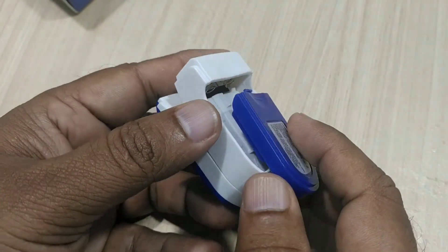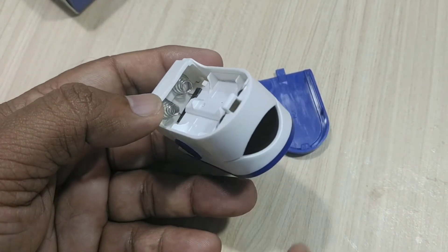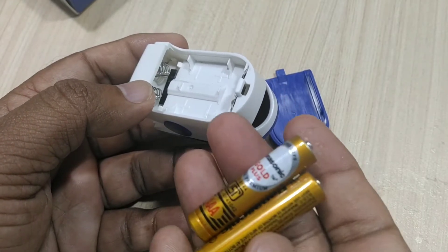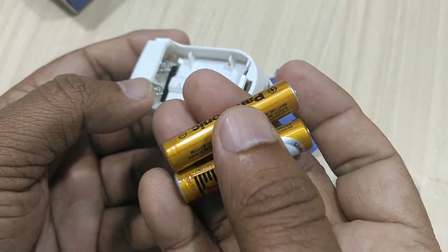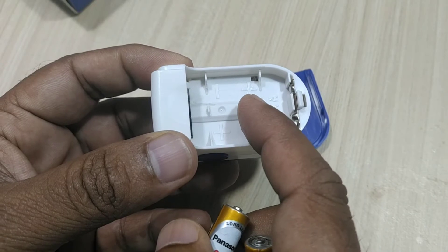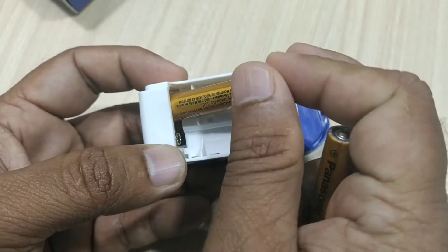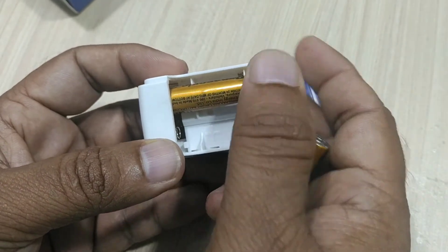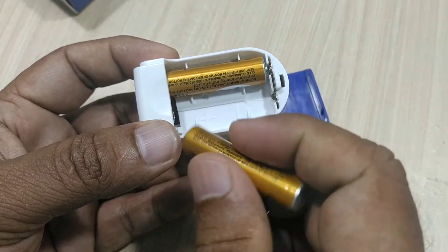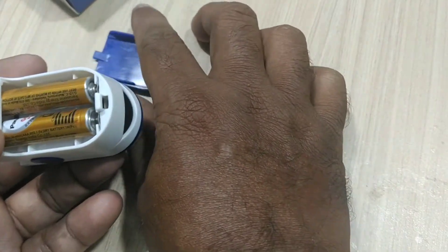Generally, AAA batteries will be supplied along with this pulse oximeter. Some sellers may not supply them, so in those cases we have to arrange two AAA batteries ourselves. This indication is also given on the device. This side we have to make positive — this is positive and the second side is negative. Keep it like this: positive on one side and negative on the other.